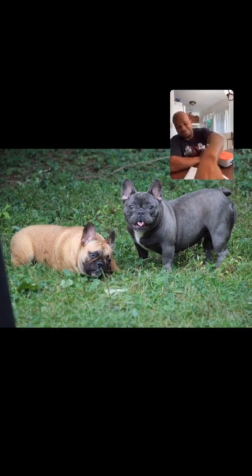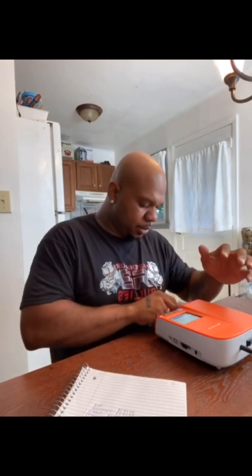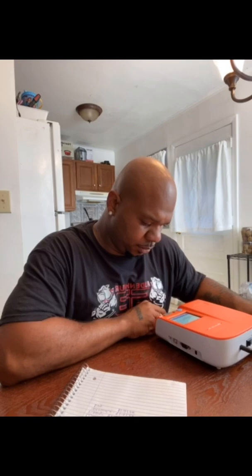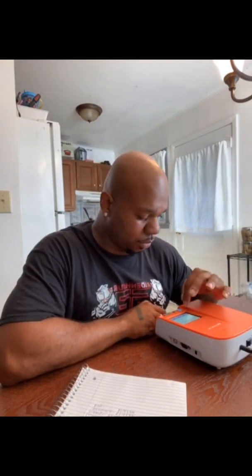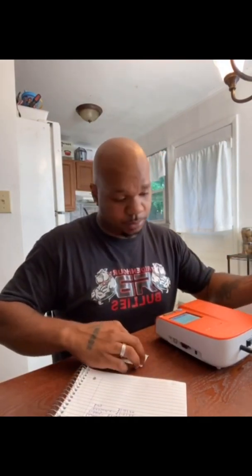I'm breeding Treasure today. Now my fourth dog — I'm going to test her right now just to see where she's at, but I'm not breeding her because to have four litters on the ground at one time — I'm not doing it. Quick test. She's at 0.424, so she's in heat but she's not ready to breed. I'm not going to breed her anyway. I just wanted to make sure it was a heat cycle and nothing else going on with her.